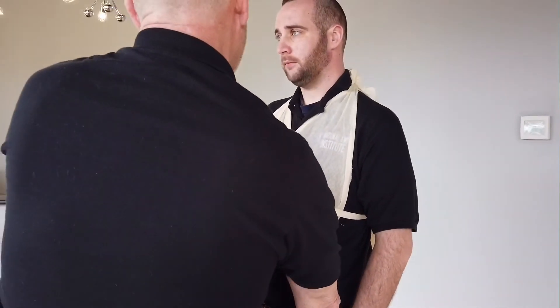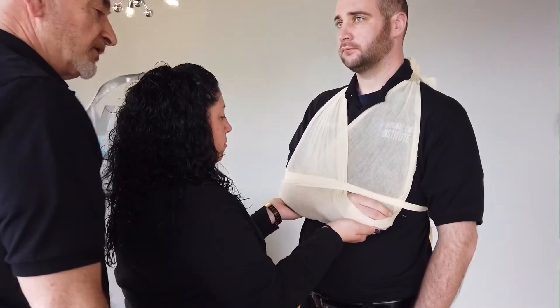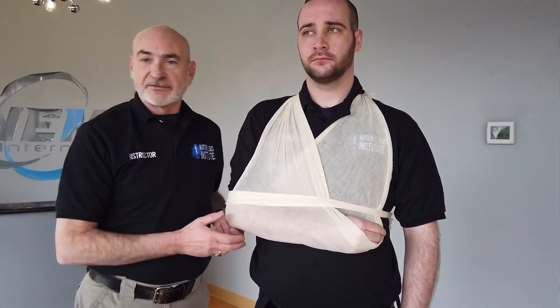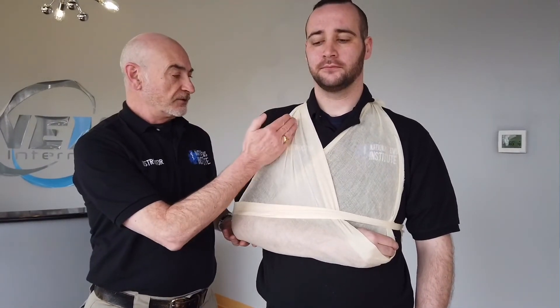Come back around to the front of your patient and reassess your CSMs: feel my touch, what am I touching, can you wiggle your fingers? At this point I can tell my partner to release, and now the arm is perfectly secure. This concludes the upper extremity splinting of a fractured clavicle, dislocated shoulder, or fractured scapula.